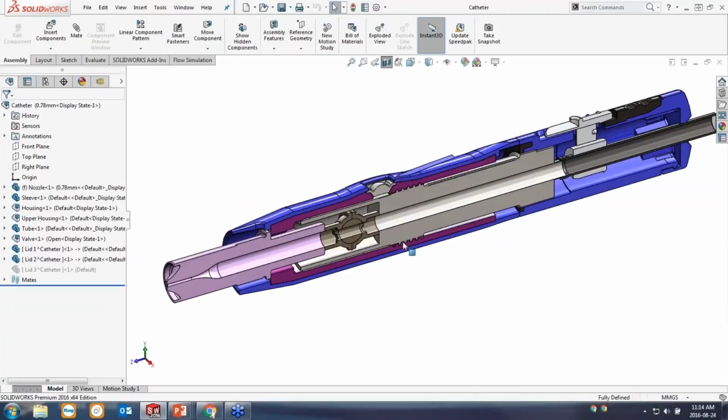We're going to go through and we're going to set up a flow simulation study from scratch, and then I'm going to take you through some other studies that I've pre-run, sort of take you through the process that I used to tweak those variables, show you some of the different capabilities of flow simulation, a couple settings that are specifically very popular when working with medical devices, and then tackle any other questions that you guys have.